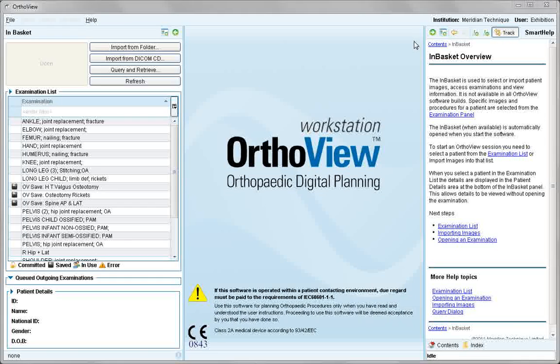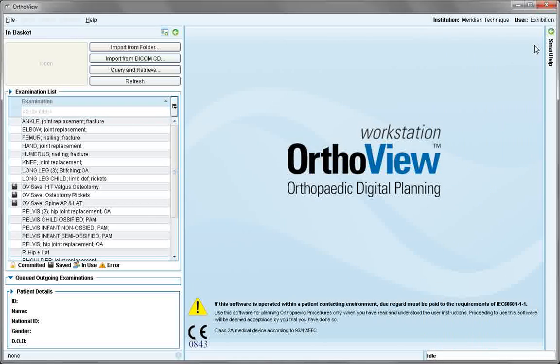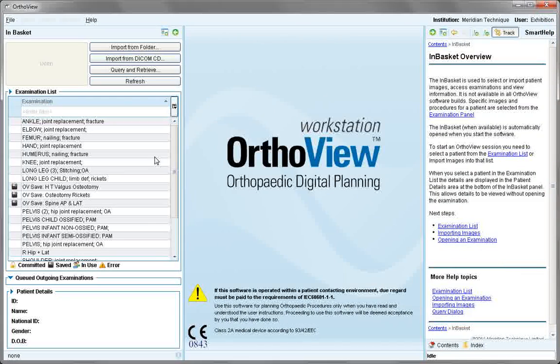The context-sensitive help menu will be available throughout to assist you with the session. When no longer required, it can be closed and hidden to one side.